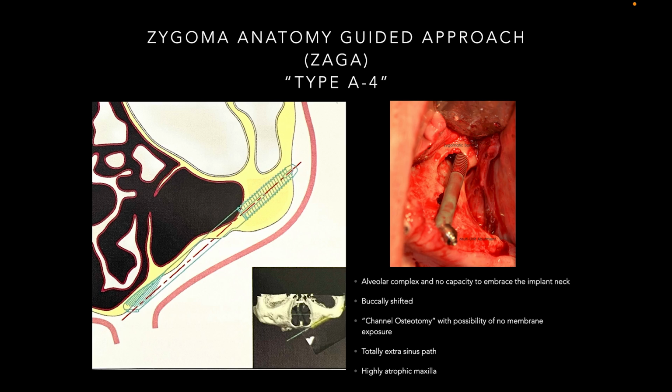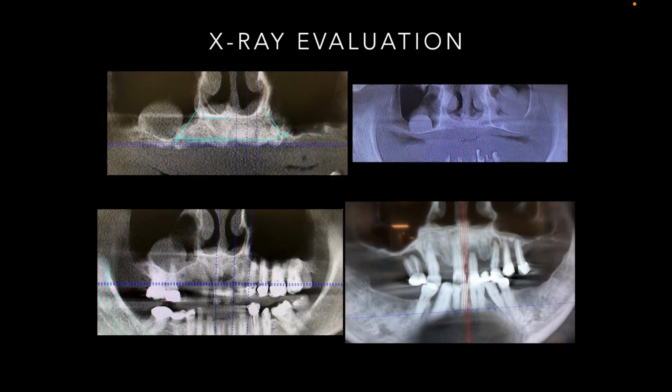Now, the problem with these is after the fact. I mean, you can get a very nice, stable implant in with good fixture and good position. The problem is that tissue going to dehisce on the buccal. These are the ones that I'm really going to cover this area with a buccal fat pad pedicle flap, to make sure that keratinized tissue forms there and we don't have any dehiscence. This is the only thing that worries me about this, is that neck becoming exposed and becoming basically a hygiene problem for the patient. So those are the classifications.